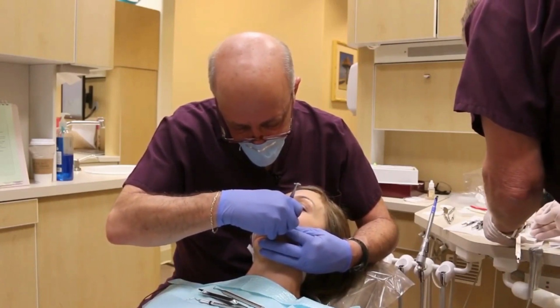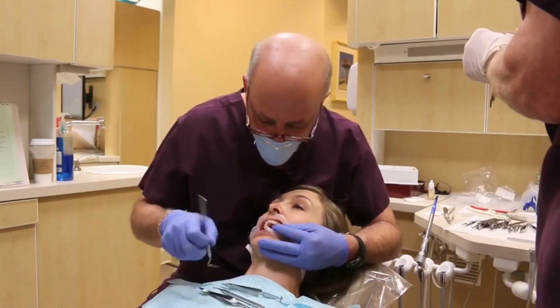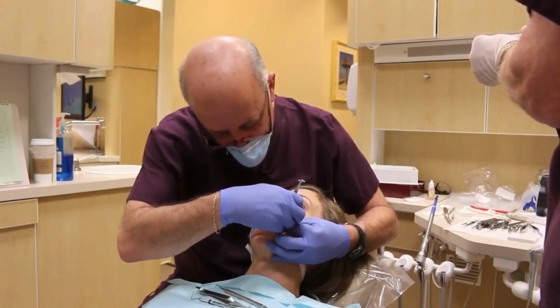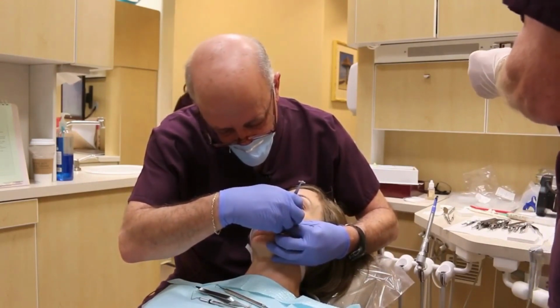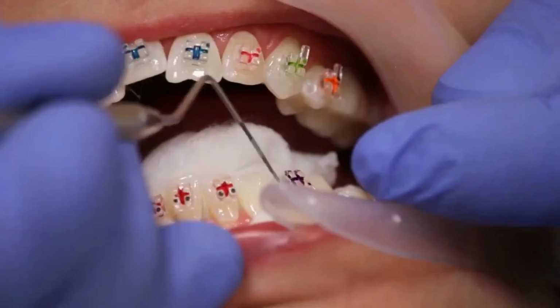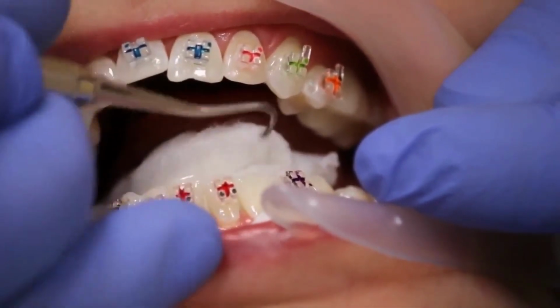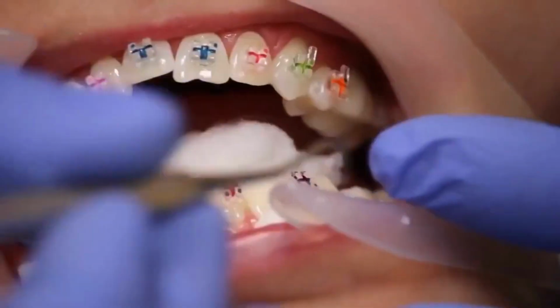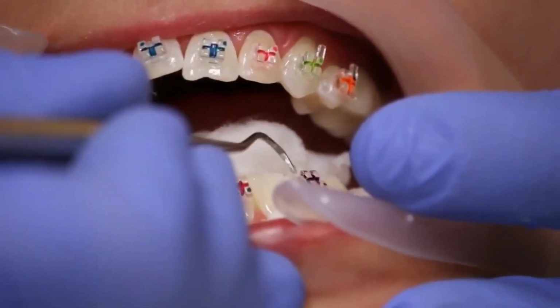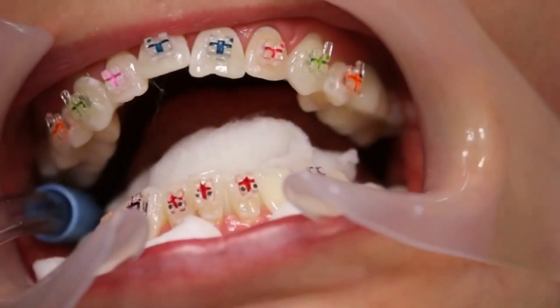Now we're at the canine. We're going to have to make a cut. And again, using the gauge, we make sure that we have the tooth at the right height. And then I look from behind the patient and above and to the right. I get up a little bit to make sure that I have placed the bracket in the right position. Okay, next.